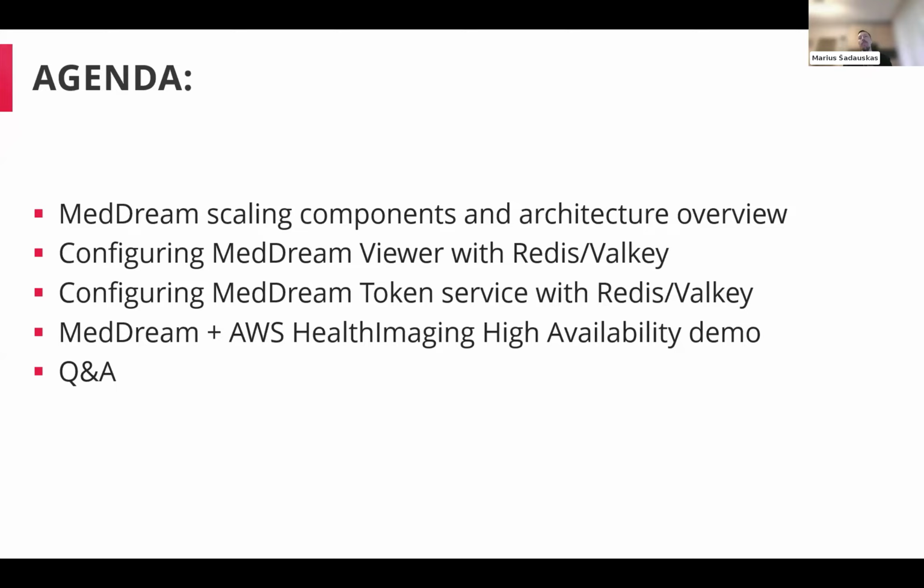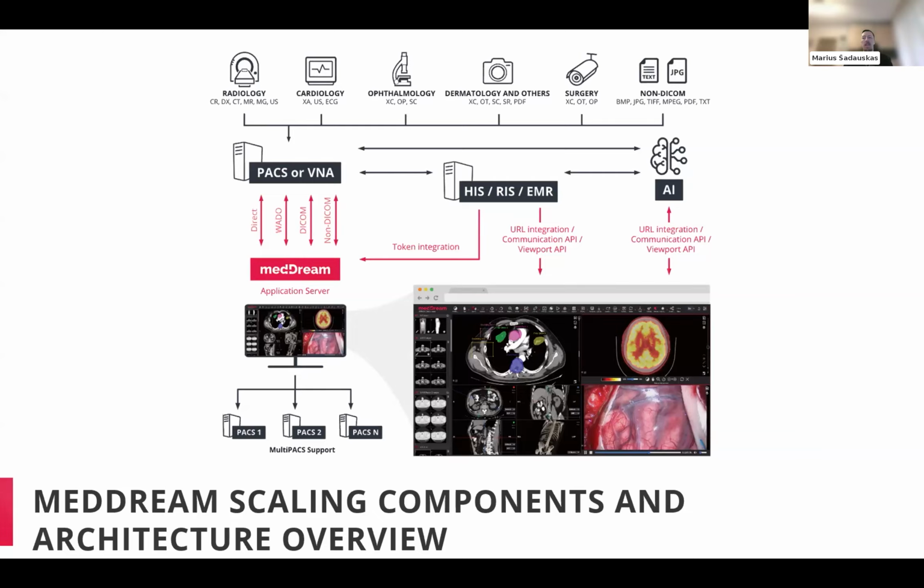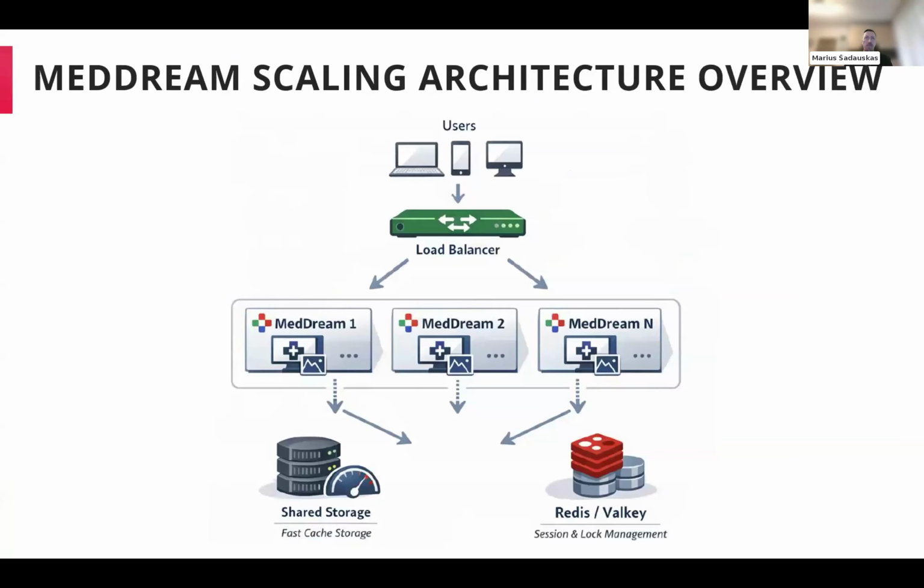As one of the main components is the session management, the configuration with Redis or Valkey service will also be gone through in this presentation, so how to configure the MedDream Viewer and the token server with the Redis or Valkey service. We will go through a MedDream and AWS HealthImaging high availability demo, and of course your questions. So the first part, let's go through the components and the architecture overview.